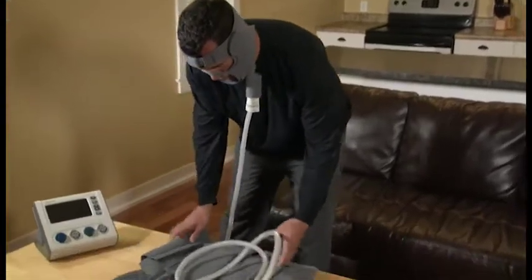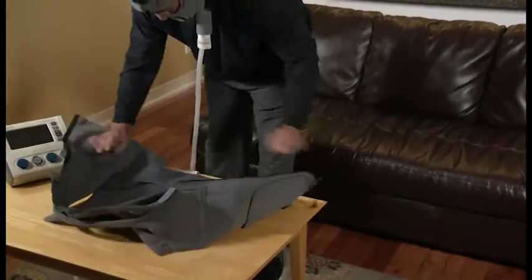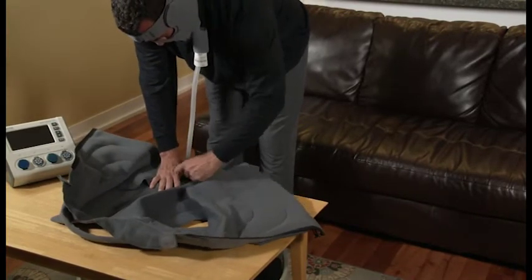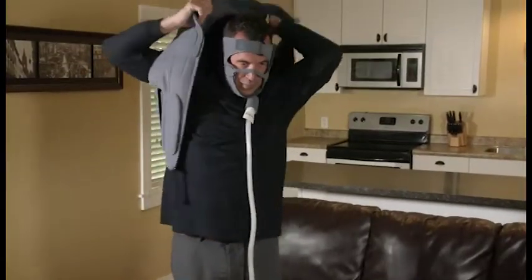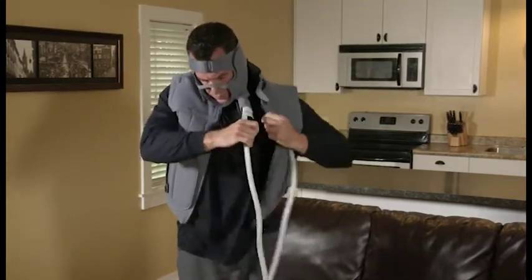To apply the vest garment, attach the hook fasteners located on the inside of the vest to the back flap of the garment so it is shaped like a vest. Then, slide your arms through the armholes as you would a jacket. Ensure the hose from the head garment is outside of the vest.